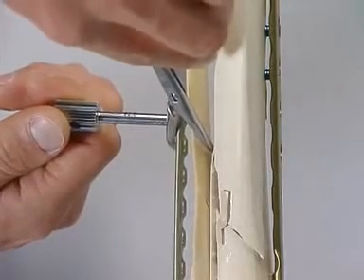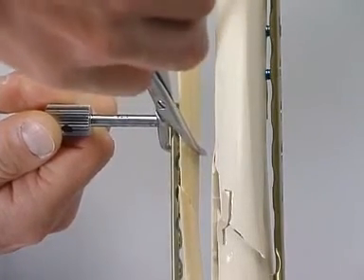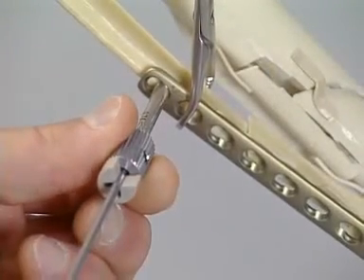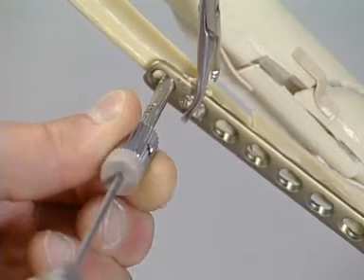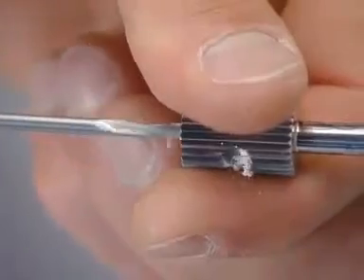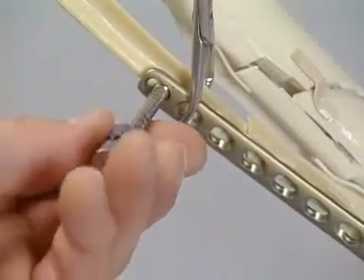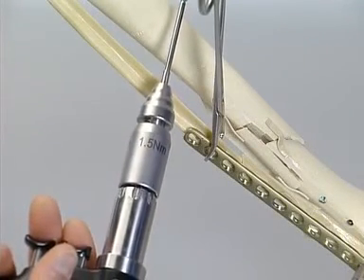The plate is initially fixed cranially onto the shaft of the fibula with the toothed reduction forceps. A green locking head screw, for which the hole is drilled using the 2.8 mm drill bit, is placed in the uppermost hole in the plate. The length is read off on the scale. The threaded drill guide is removed, and the selected locking head screw is inserted using the air drive fitted with the torque limiting attachment.